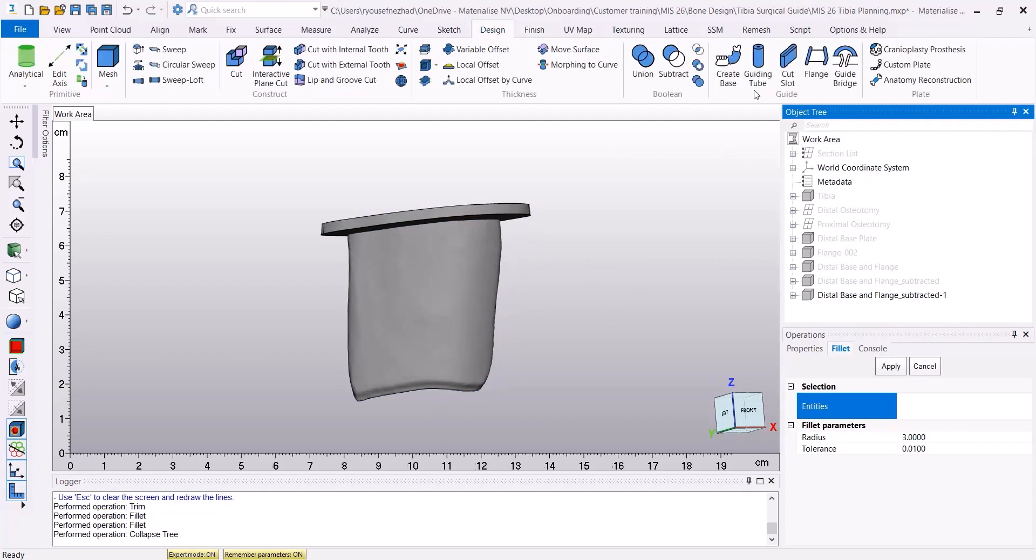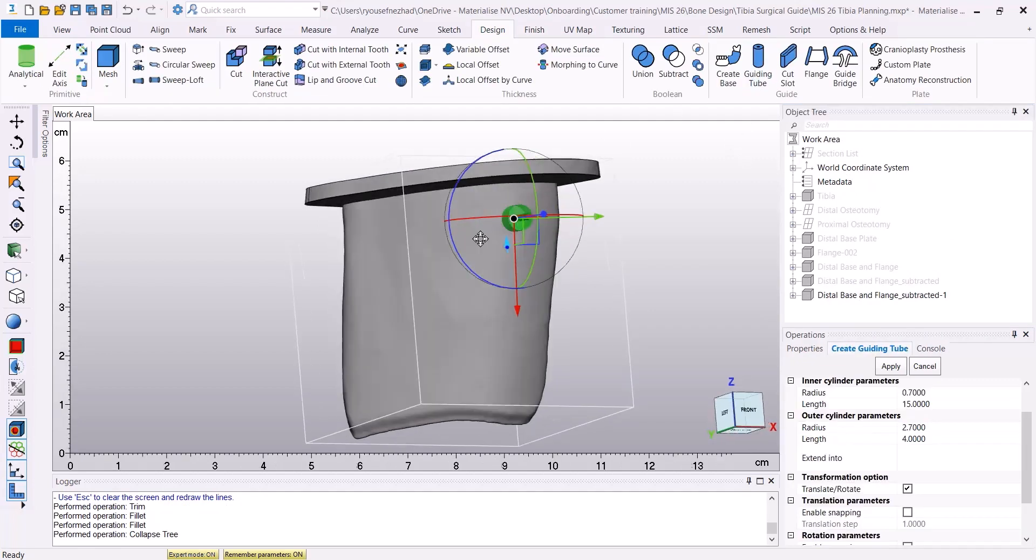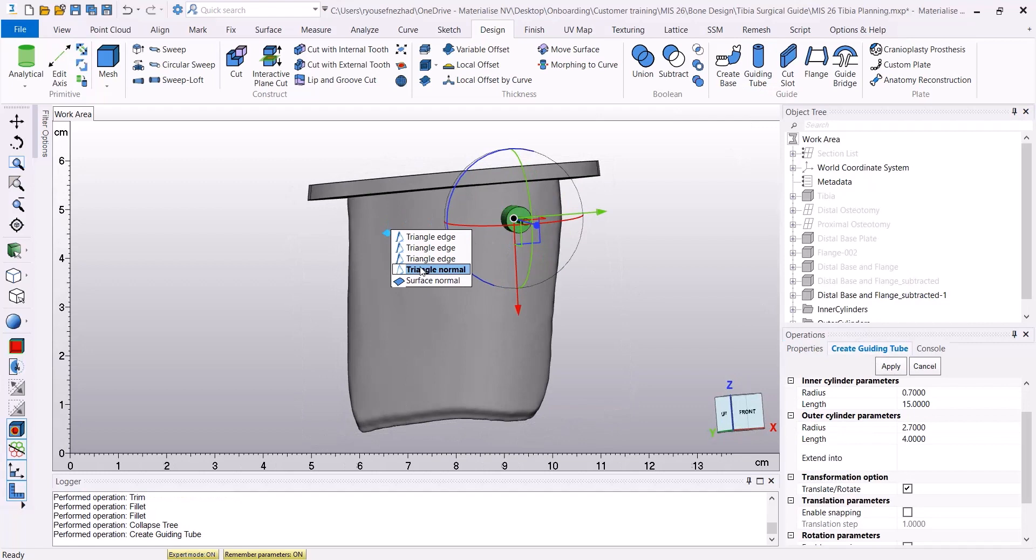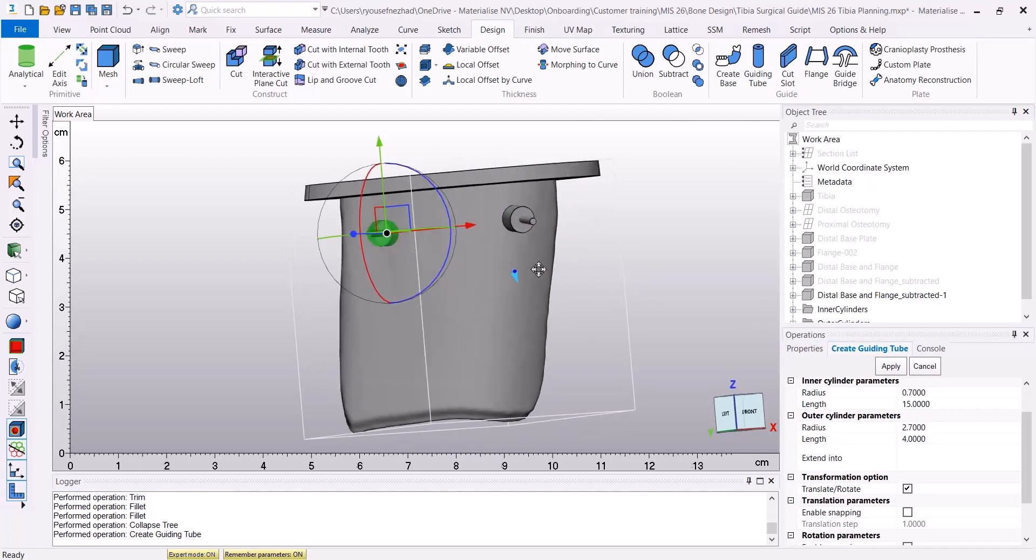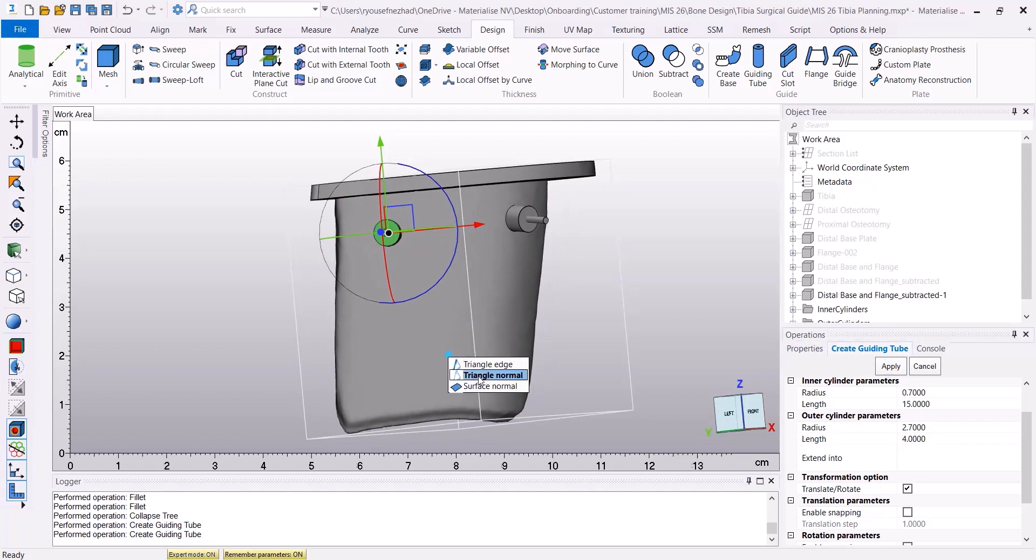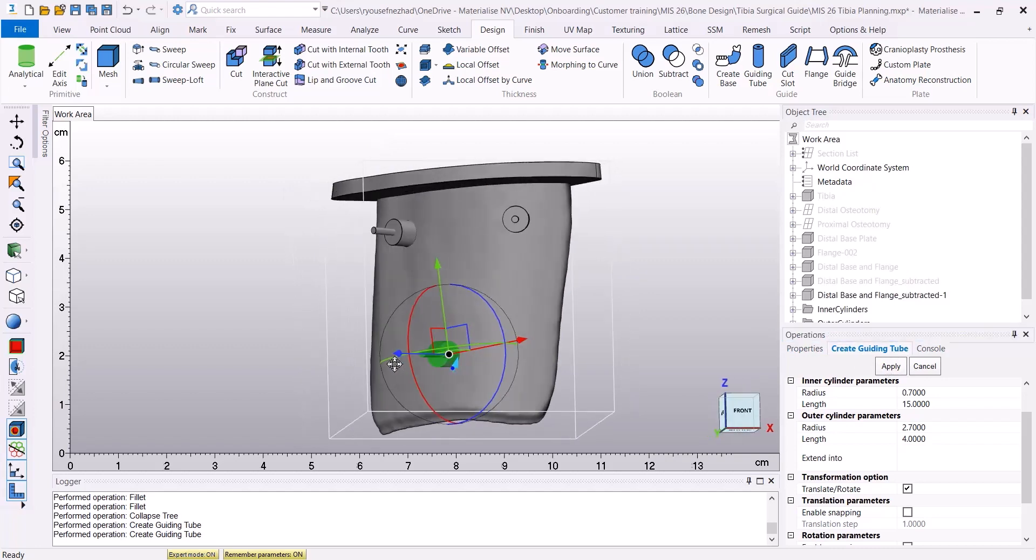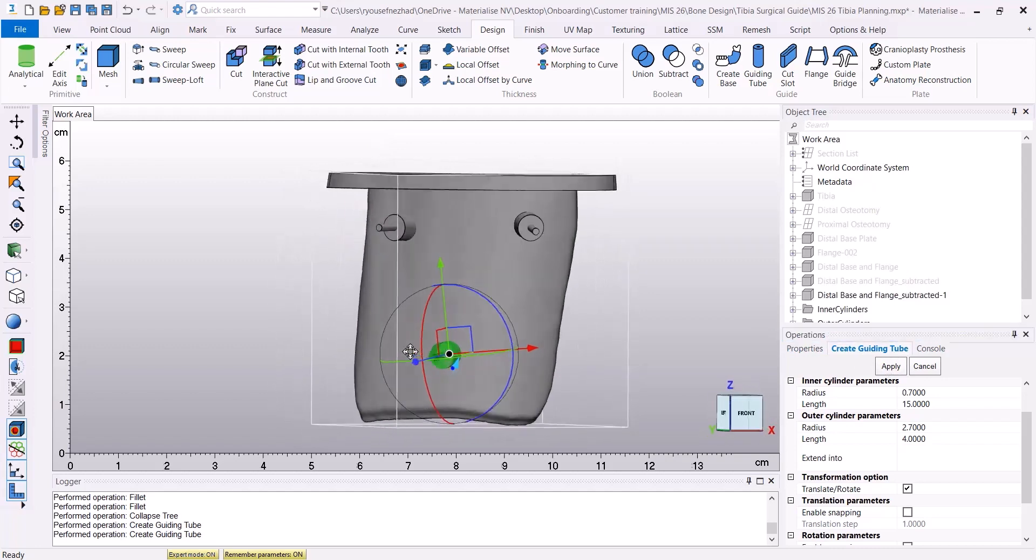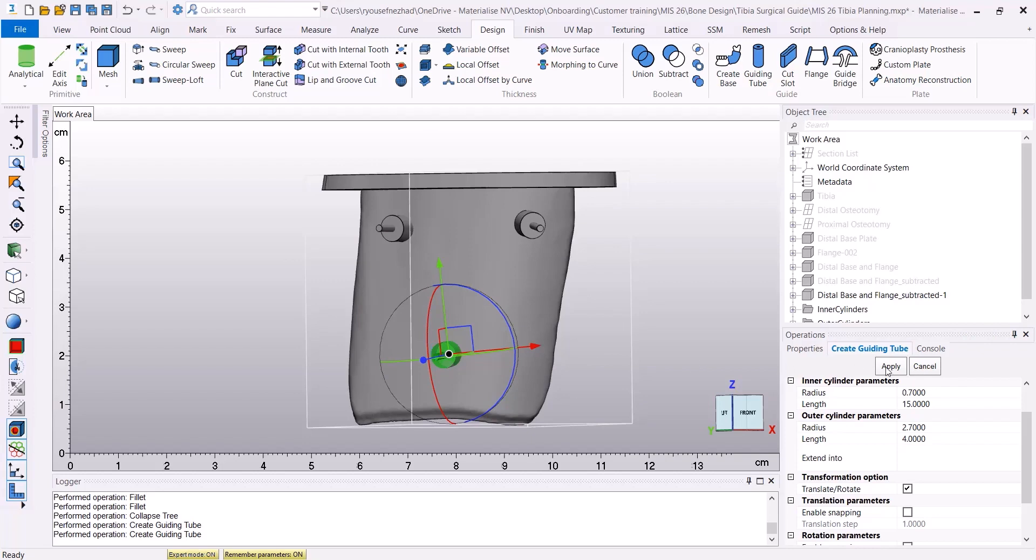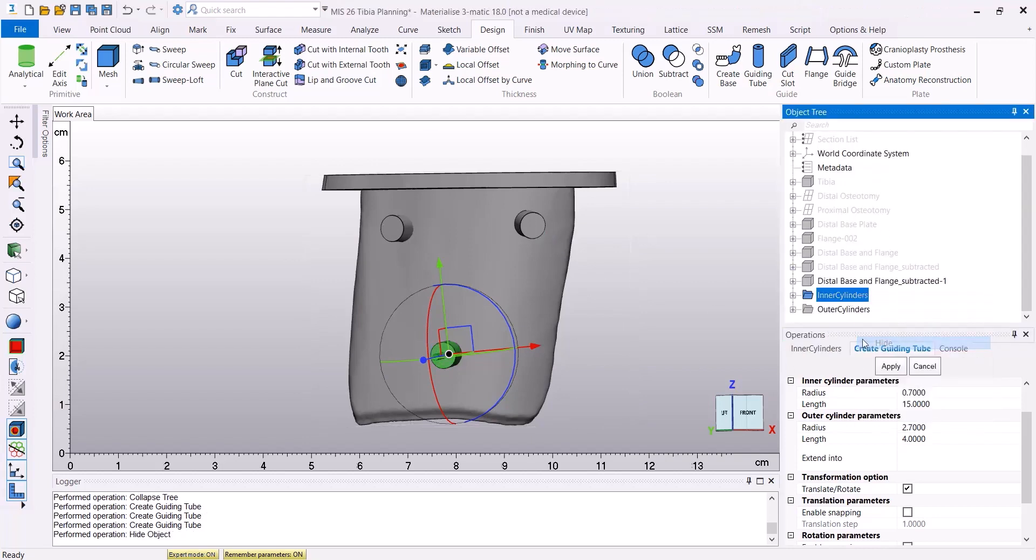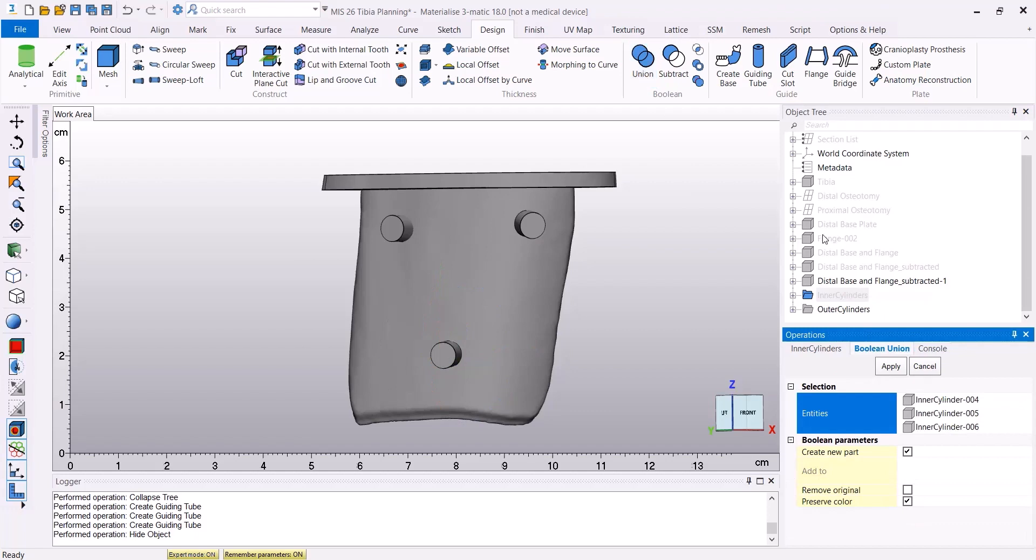In the next step, we're going to create some guiding tubes on the surface of our guide base, using the Guiding Tube tool. By selecting a point on the surface of the base, the guiding tubes will automatically be created, and as a result, we're going to have the inner cylinders and outer cylinders in our object tree.